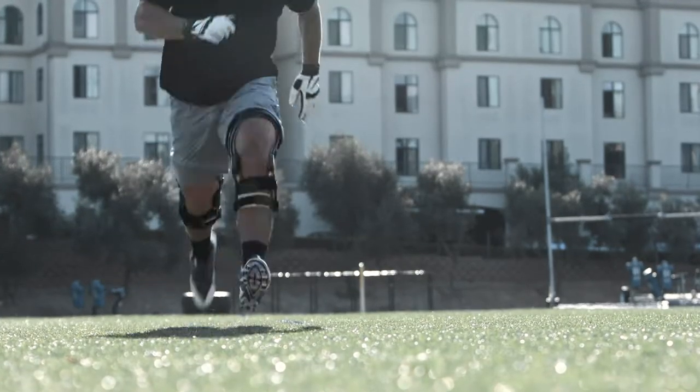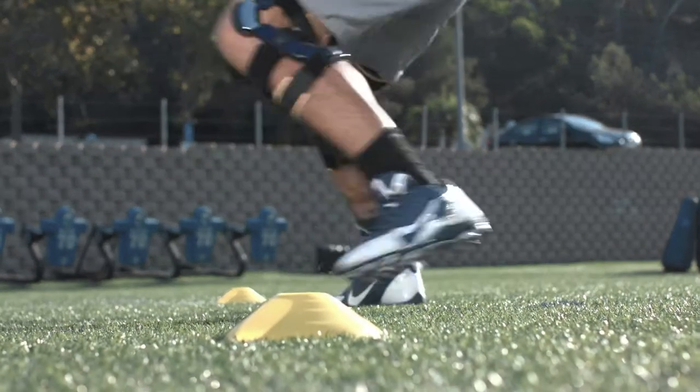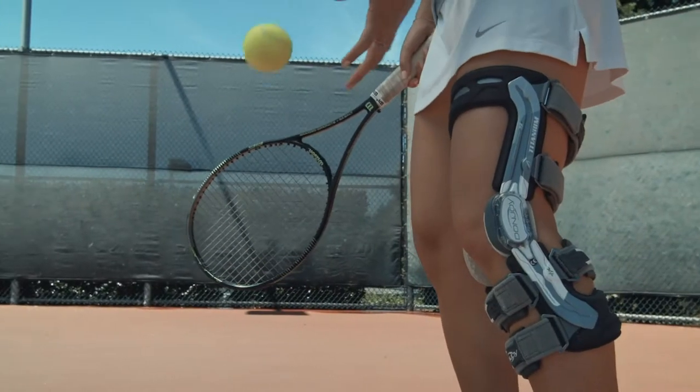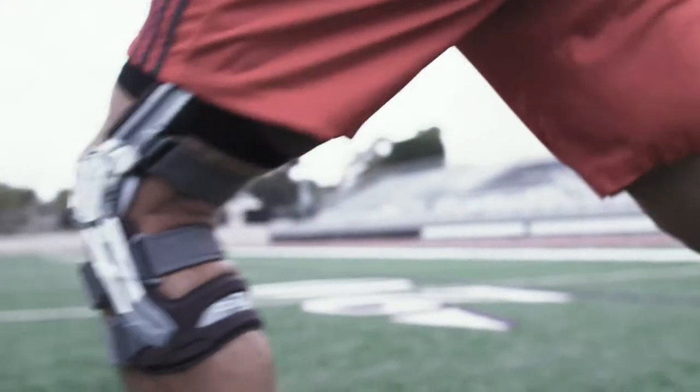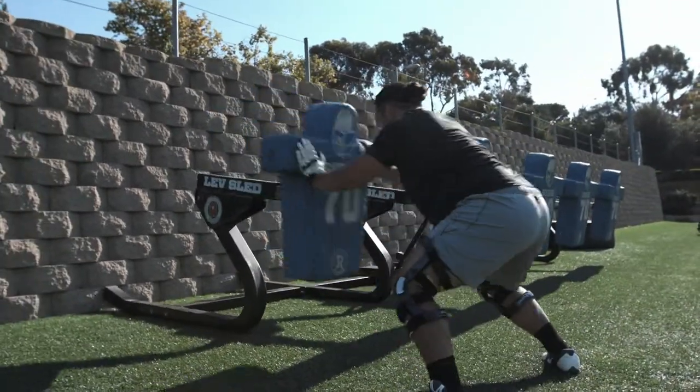By incorporating both four points of leverage and ForcePoint technology, you in essence have double insurance. You're going to keep the knee out of the at-risk position, but in the event you are at risk because of an enormous load, you have that four-point technology to load the tibia in the direction it wants, helping protect the knee.